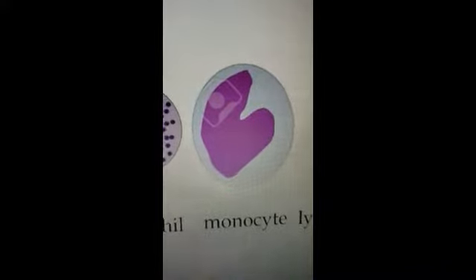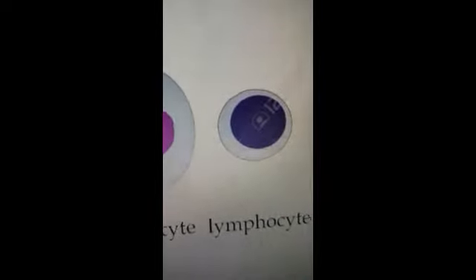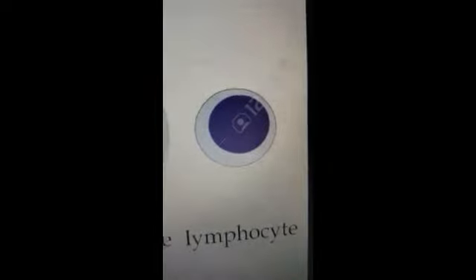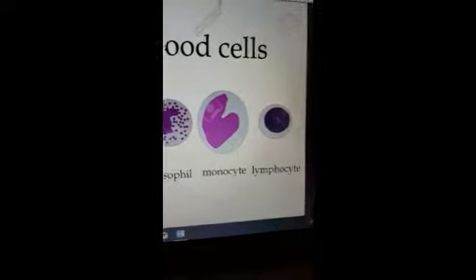So that's when we end up seeing more of those. And then finally, we have our lymphocytes. These are pretty easy to spot compared to the other ones because they look a bit different, and they've got that large, dark staining nucleus that makes them easier to differentiate from the other types of white blood cells. And when we're seeing a lot of lymphocytes, it can be due to things like infection or some inflammation in the body somewhere. So that is our different types of white blood cells.